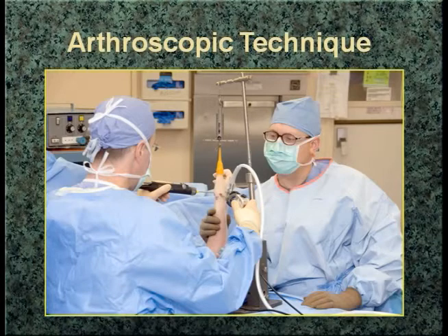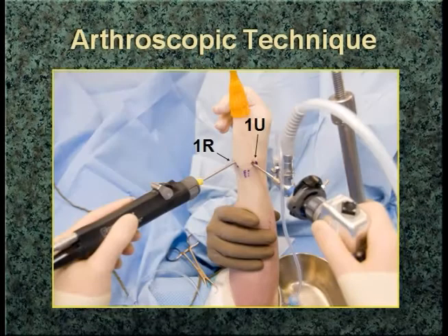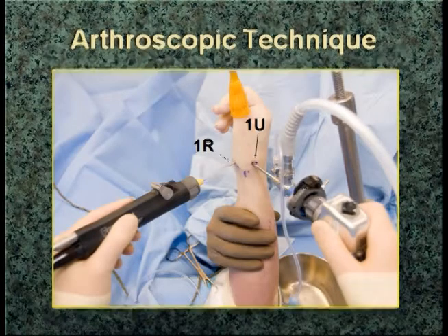Here you can see the basic setup. You need help in the OR with you. It's only thumb traction — viewing from the 1U and then eventually switching to the 1R. The 1U hugs the first compartment, and the 1R, as Dr. Chow described, is just radial to the FCR tendon, which tends to put you further away from branches of the artery and branches of the nerve.